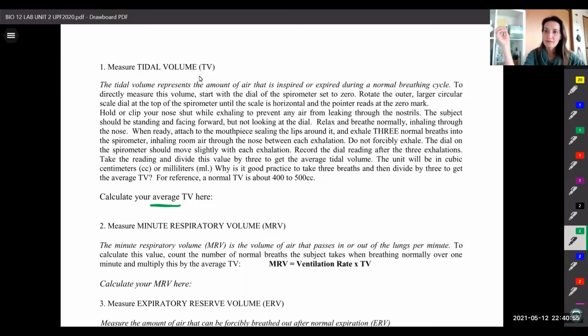And on top of that, with each one of these measurements, you have to make sure that you plug your nose, right? Why is that? When you exhale, right, into a tube, why do you want to plug your nose? To get an accurate reading. Like all the air is just coming out of your mouth instead of your nose, so you don't lose air.